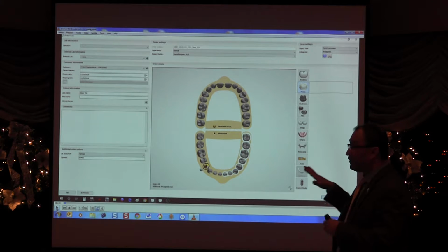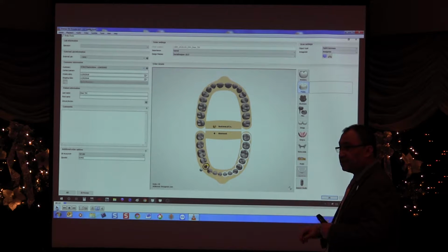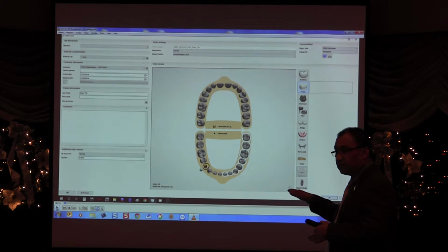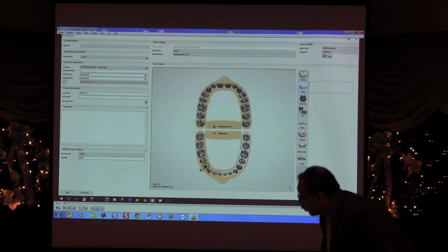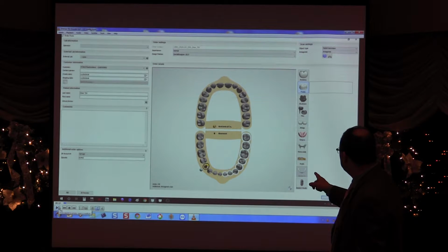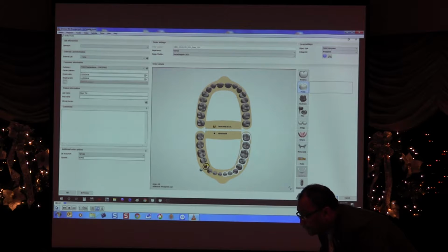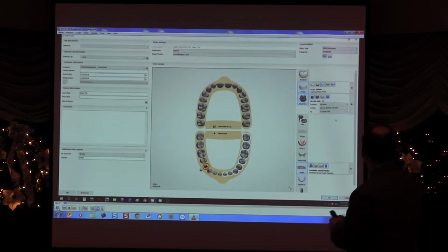So the way this video is made, I was designing an encode abutment and a crown, while we were capturing the screen, so I'm going to stop and pause and play. And meanwhile, if you have any question while it's being designed, we can certainly stop and you can ask the question. So we open up an order form in our lab system. Since it was a model, we scan the model first, and from that phase, you can look at it here.